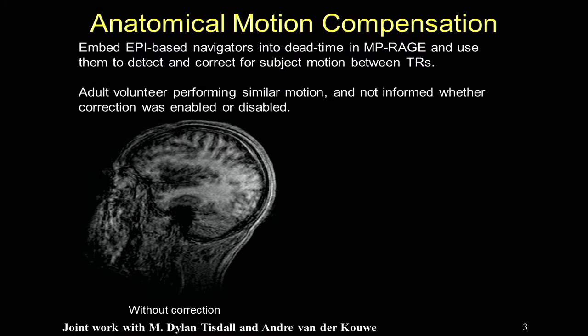Okay, so within and across subject motion. So probably many people in this room have collected data that looks like this. And this is what happens if you collect an MRI scan and your subject moves around while you're acquiring the data. But in MR, we are almost always sacrificing signal for contrast. We're almost always waiting around for magnetization to recover or decay or do something that enhances the contrast of our images. And if you're a subject in an MRI experiment, I encourage you to sit and listen for when there's dead time. Is the scanner going constantly, or can you hear kind of moments of silence between the clicks?